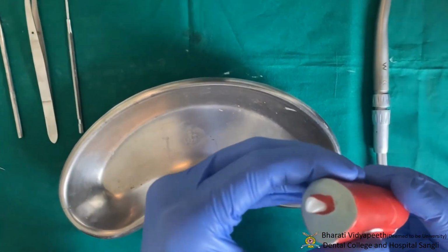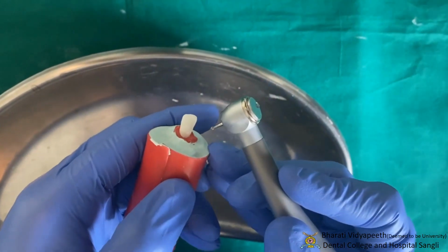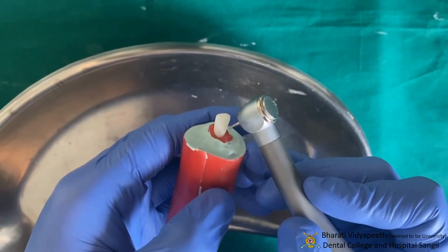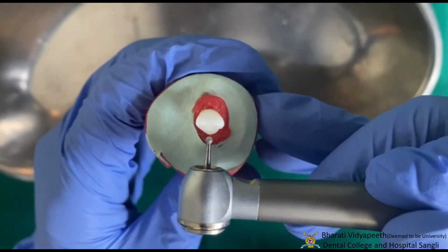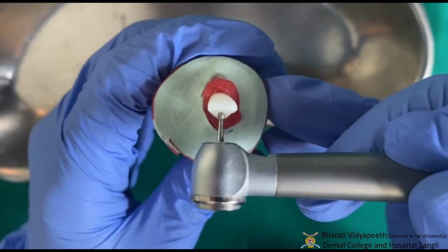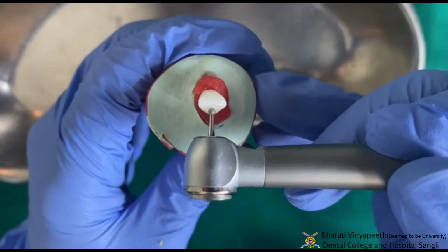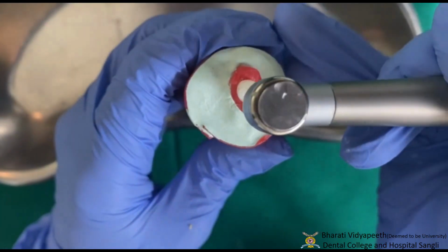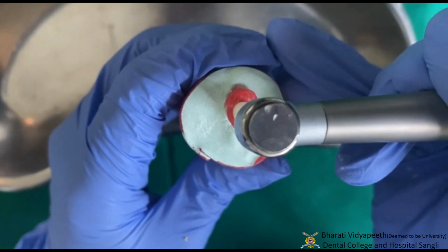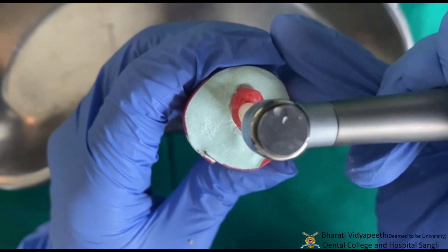Let's see the access opening of the maxillary lateral incisor. The internal anatomical structure of the maxillary lateral incisor dictates the shape and size of the access opening. First, the enamel is penetrated at the center of the lingual surface at an angle perpendicular to it with the help of a number 4 round bur in high speed. After penetration of enamel, the bur is directed along the long axis of the tooth until the pulp chamber is reached. A drop of the bur into the chamber is felt if the chamber is large enough.